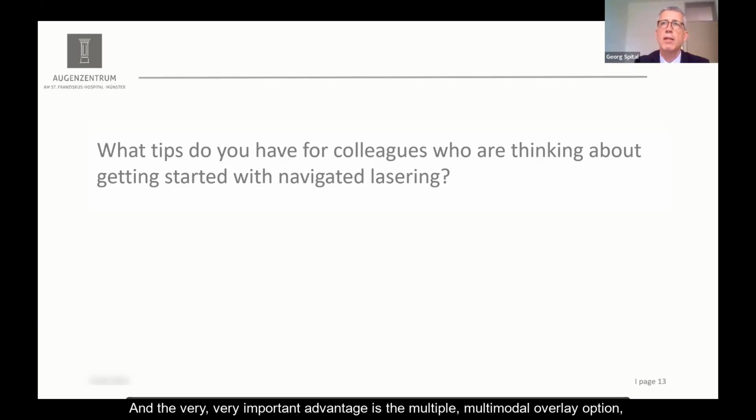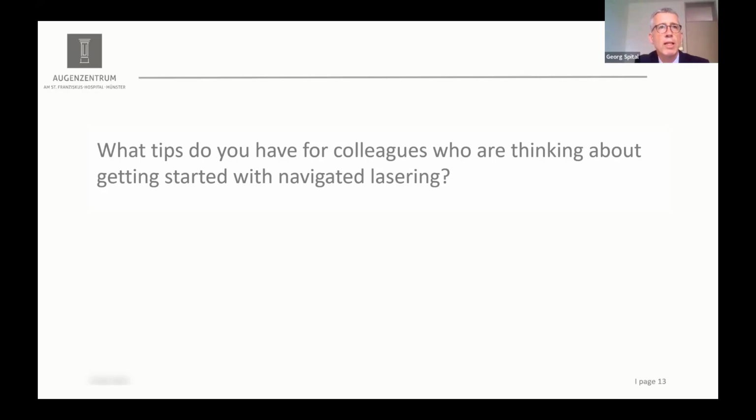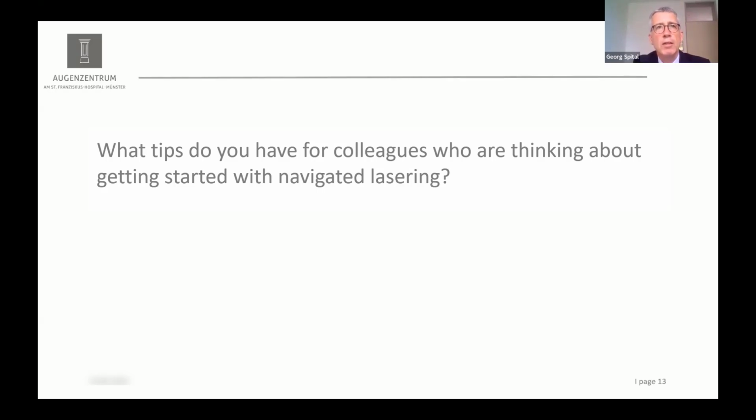And the very important advantage is the multimodal overlay option, which I always use when we have indications close to the fovea, in order to be able to mark the fovea exactly beforehand with the OCT on top. And this OCT image, which shows where the layers are thinnest, the fovea can be identified very clearly on that, which means that you can delineate the marked fovea very clearly on the fundus image and set up the corresponding zone where no laser treatment should be performed.